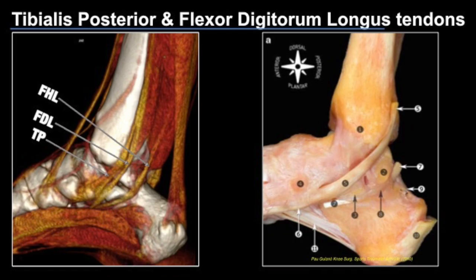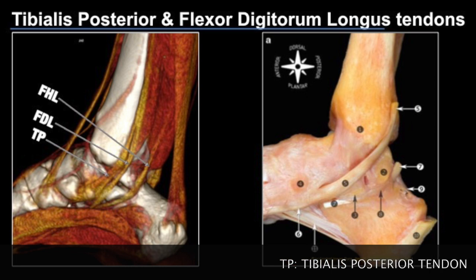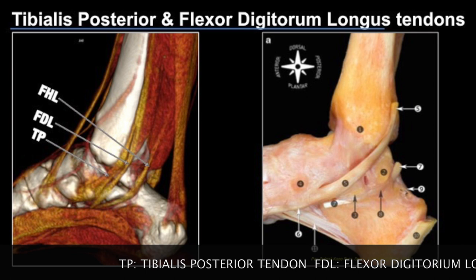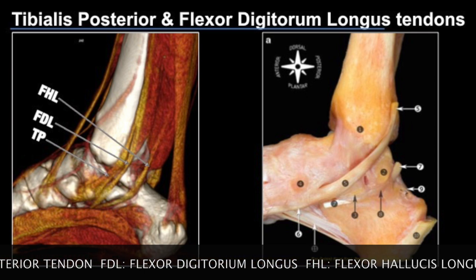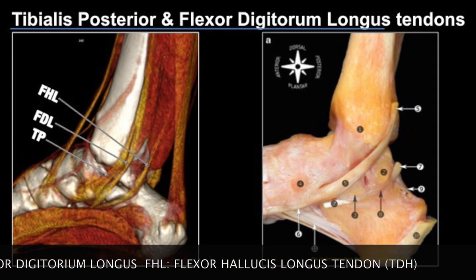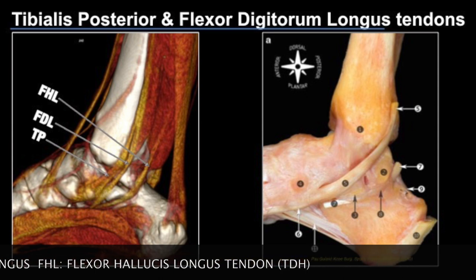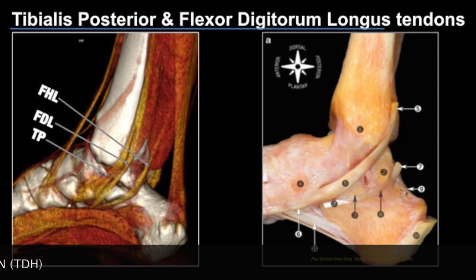This is a volume rendered image where we see the location of the tibialis posterior tendon. Just adjacent to that we have the flexor digitorum longus tendon, and a little bit more posteriorly we have the flexor hallucis longus tendon as it passes between the two tubercles of the talus. So that's the tibialis posterior, the flexor digitorum longus, and the flexor hallucis longus.